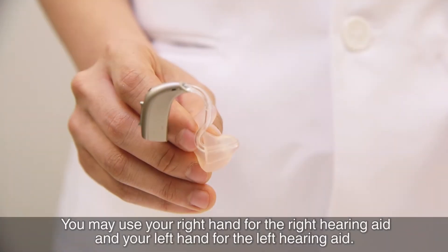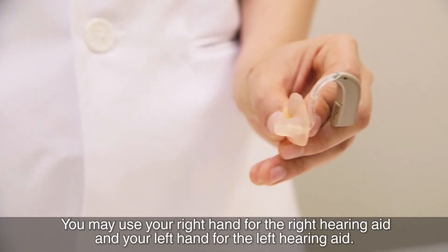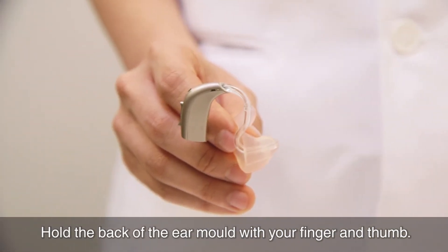You may use your right hand for the right hearing aid and your left hand for the left hearing aid. It is important to hold your hearing aid correctly. Hold the back of the ear mould with your finger and thumb.